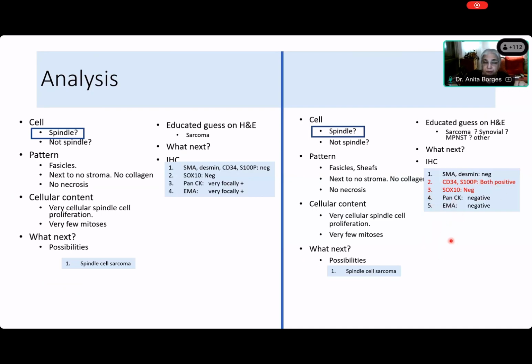Okay, so now let's come to 5A. Should we think of a synovial sarcoma? The answer is yes. Why? Because PAN-CK and EMA were focally positive. It is a very, very cogent diagnosis. Yes. Over here, we have to do something else because now what is this funny thing? CD34 and S100 protein. It is, of course, unlikely to be a synovial sarcoma. That one is likely to be a synovial sarcoma.